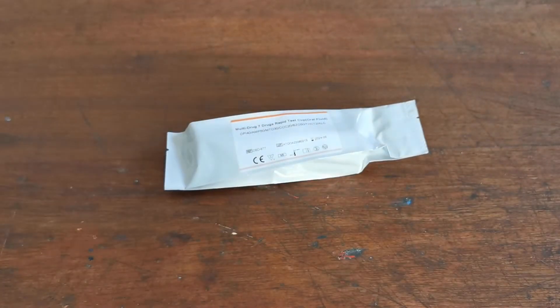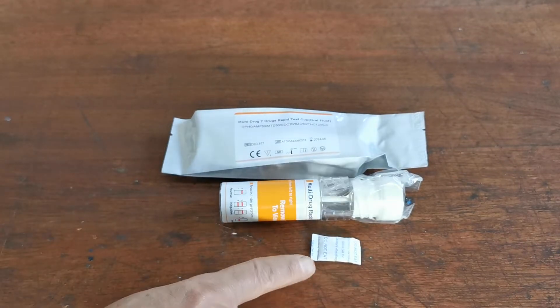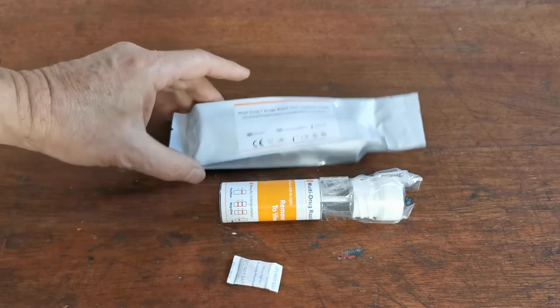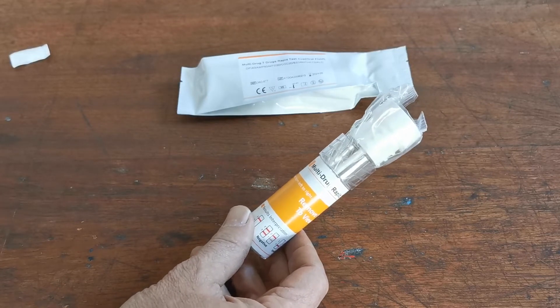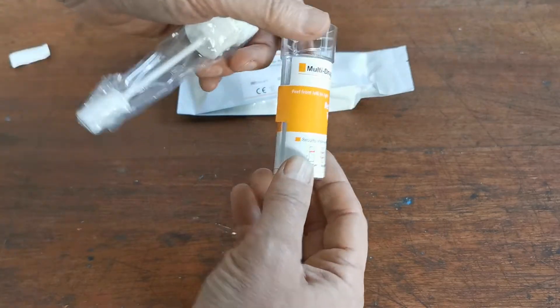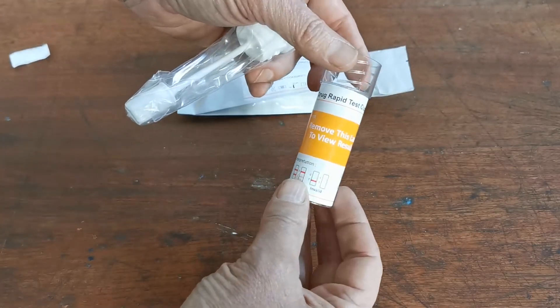What's in the foil when you open it? You get a foil pouch of desiccant, which keeps the test in dry condition throughout storage — dispose of that once you're ready to do the test, and only open the foil just before testing. Inside you also get the barrel with a foil or paper cover over the results window.